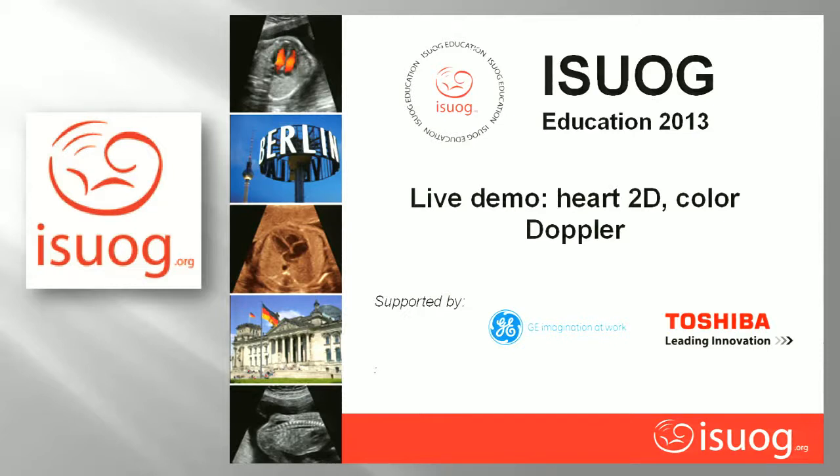This is why if you have a systematic approach, you will not fail. But if you are waiting for something to happen, you will not achieve the final diagnosis in the end. In general, it's easier to show you nice images of a normal heart, but it's quite challenging to find a rare abnormality and get good images, because the fetuses are not waiting for you until you get the proper picture. On screening, you are limited in time.